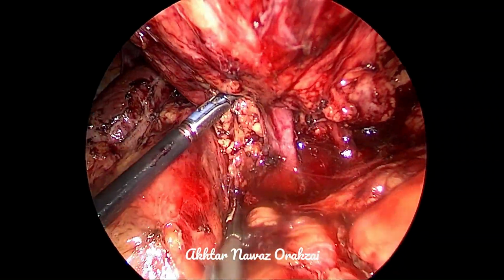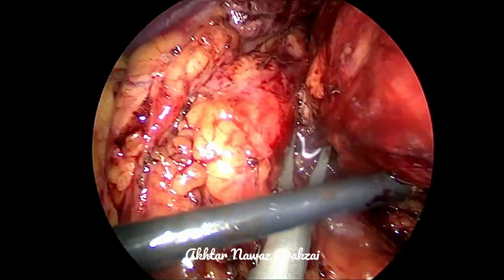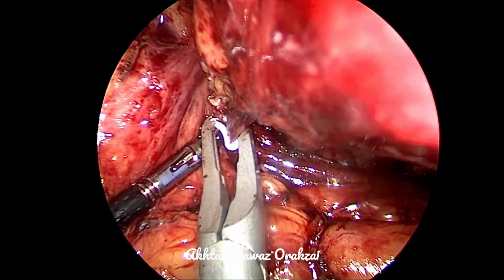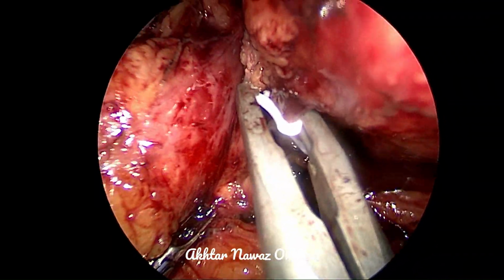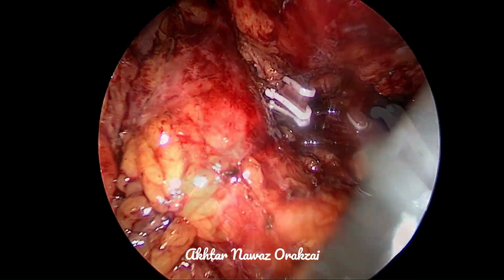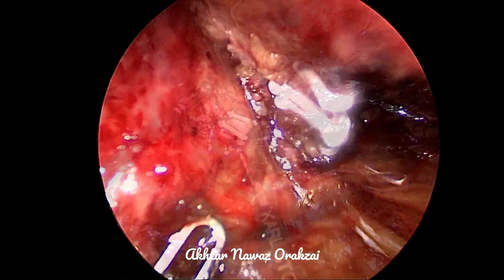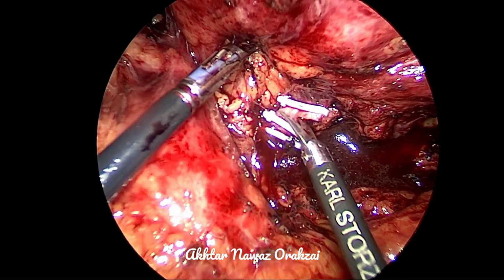Once that is done, we'll be able to clip and divide the renal vein, and then of course we will go back to the renal artery to dissect it more, apply more clips, and then divide the artery. And hence, after doing the hilum, we'll be doing the rest of the dissection, mobilizing the kidney from the lateral aspect, the posterior aspect, superior pole, and then dividing the ureter, and hence the nephrectomy will be completed.